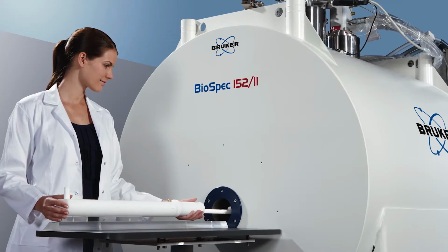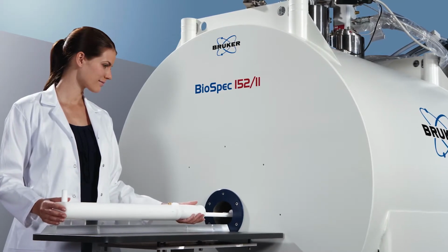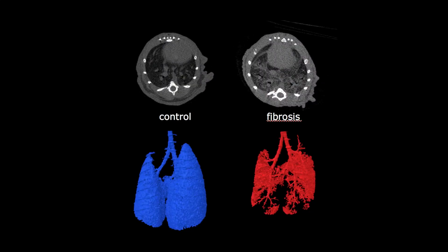MRI is also used for imaging things that normally can't be seen. Ultra short TE, or very fast imaging methods, are able to collect images of things like plastics, which historically have been invisible to MRI, but new pulse sequences and new methods have allowed us to see plastics, bioimplants, polymers, rubbers, things that normally don't show up. They can also see some of the tissues in the body that don't show readily, things like cartilage, or even the lung tissue, which is normally very soft.